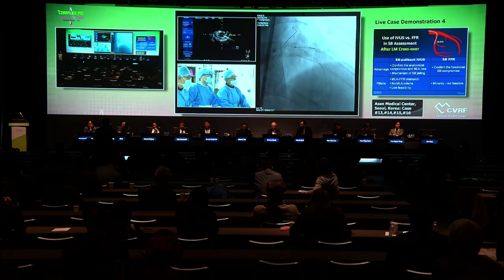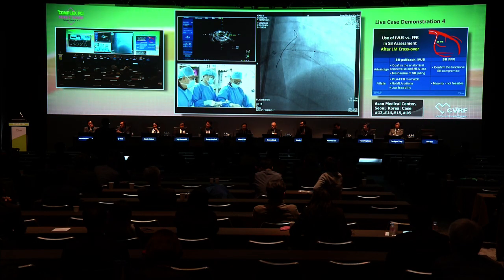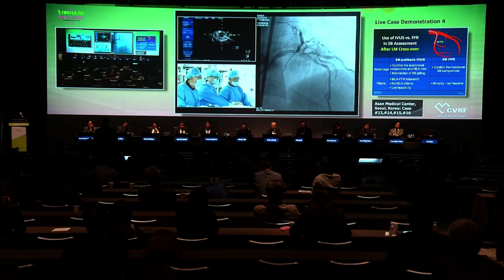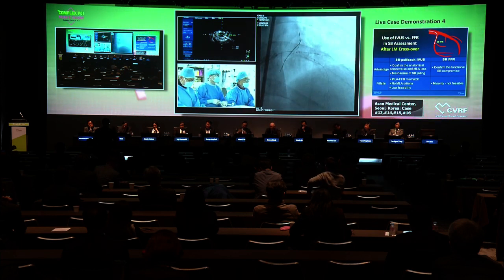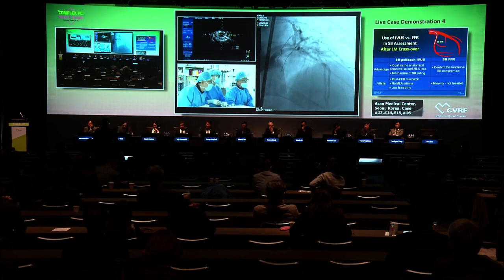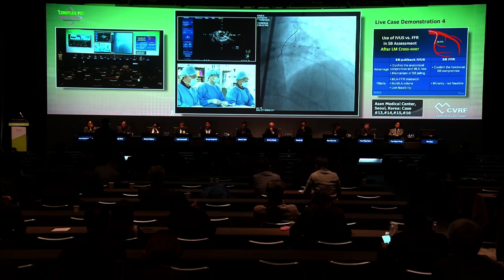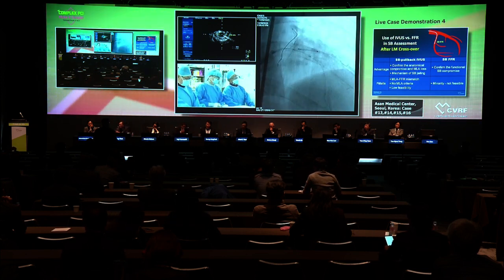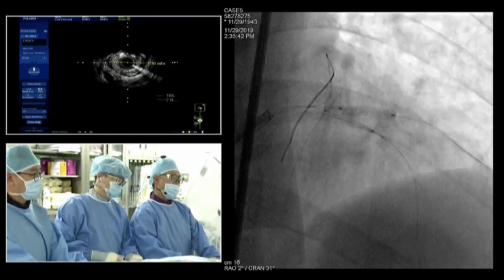It's very difficult to answer this question because we have only a randomized study in left main with DK crush against provisional T-stenting, and this study is in favor of DK crush. But the problem is that in this study, the lesion length of the circ was 17 millimeters, so we cannot treat this kind of patient with only one stent. So this is one of the issues of DK crush. Now, in this particular case, I will not do DK crush, for example.